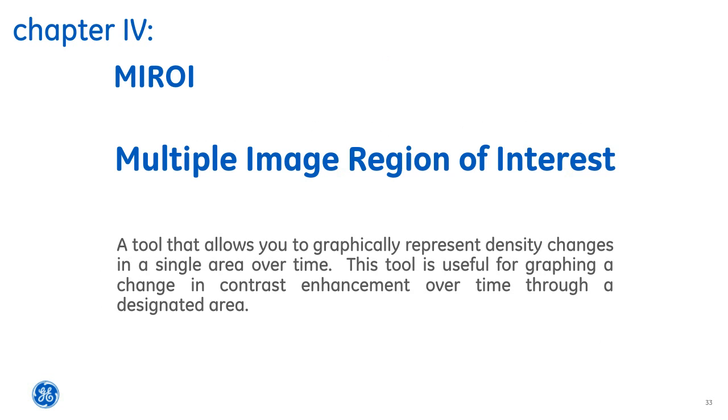So MIROI, and this stands for Multiple Image Region of Interest, is in principle a similar process to your Smart Prep. It gives you the optimum peak enhancement of when we're going to acquire the scan, but there's a slightly different workflow to it.